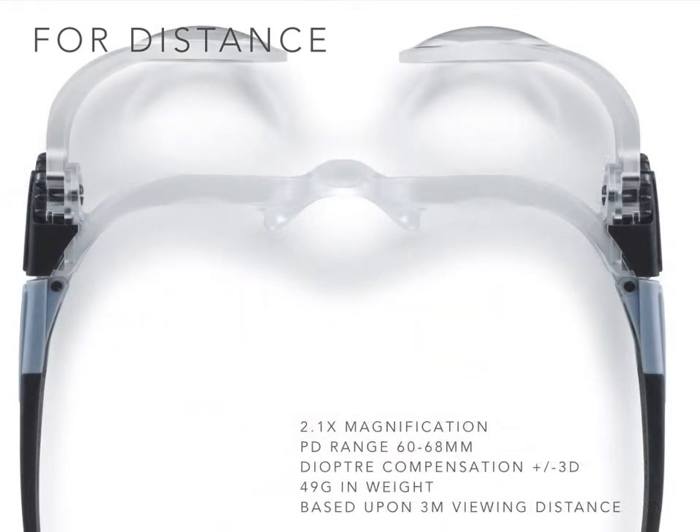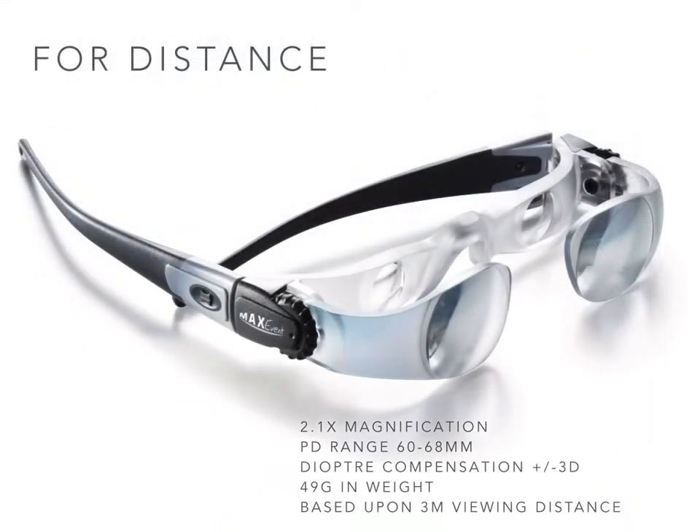Also for distance viewing, this third device in the same range has been designed for viewing far distant objects. Users benefit from the similar two times magnification, and with a focus range beyond 3 metres it may be used, for example, at concerts or outdoor sporting events. For long-distance viewing events, the user benefits additionally from the anti-reflection coating seen here on the front set of lenses.